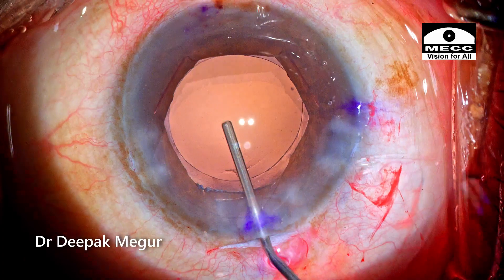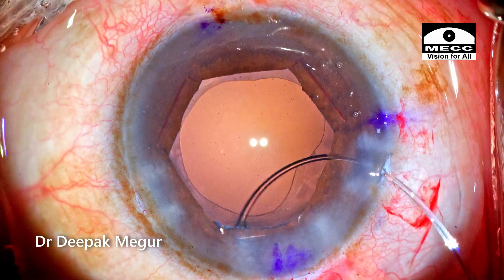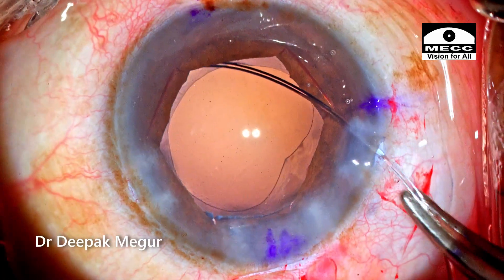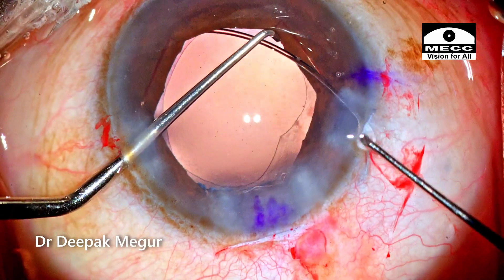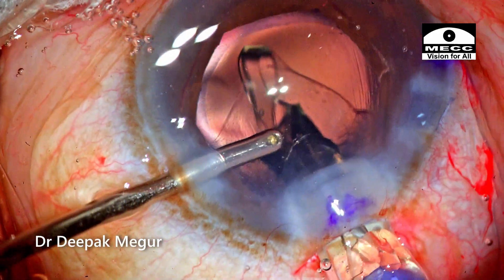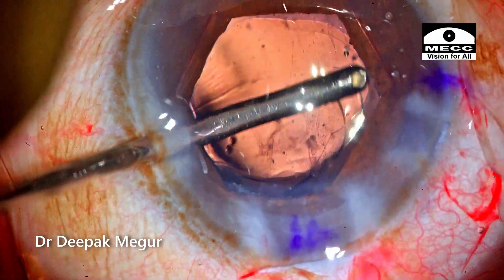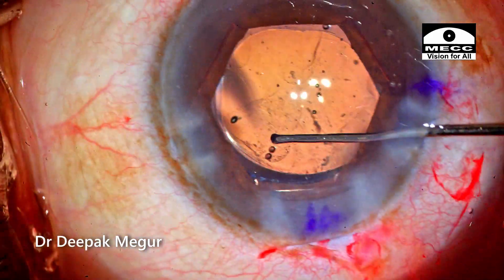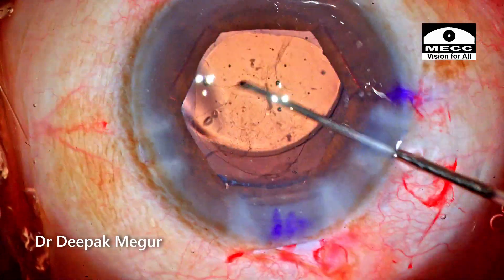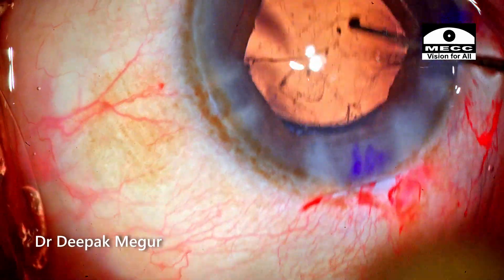In this case I've decided to use a capsule tension ring because the patient had pseudoexfoliation, and I believe it ensures better centration of the lens within the bag. The intraocular lens is then implanted into the bag. Before removing the OVD, I'm mobilizing the toric IOL approximately 30 degrees away from the intended axis.